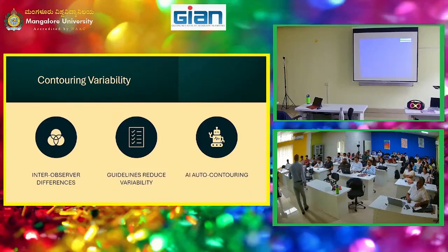The reason is because we're all different, right? We all have different perceptions. We've all been trained differently. But just imagine if you're the oncologist or the radiation therapist, and you're given these three segmentations. You're like, well, which one do I pick? Do I just pick the average? That's a huge problem, and that's where you come in.